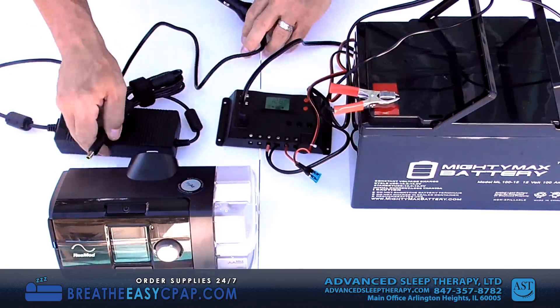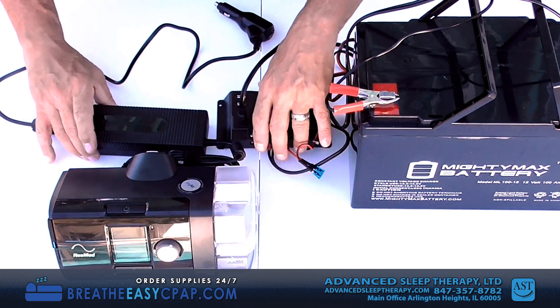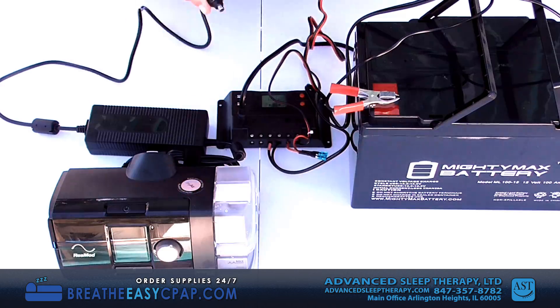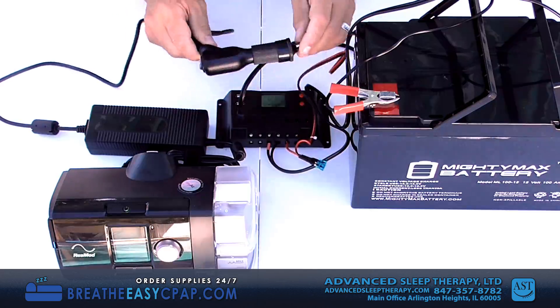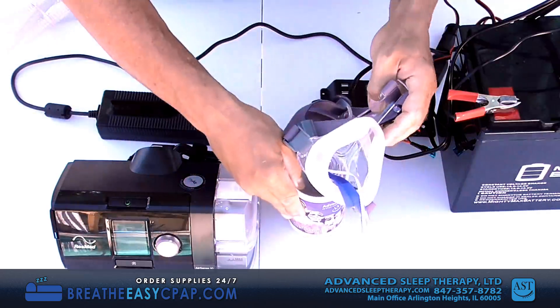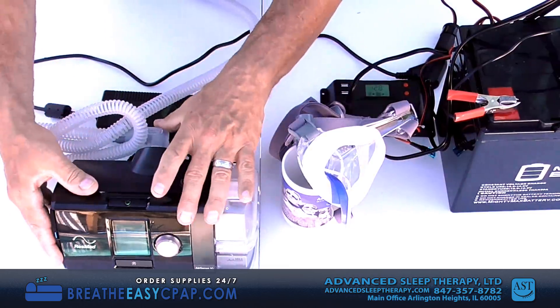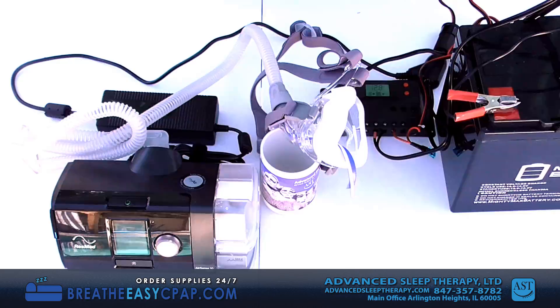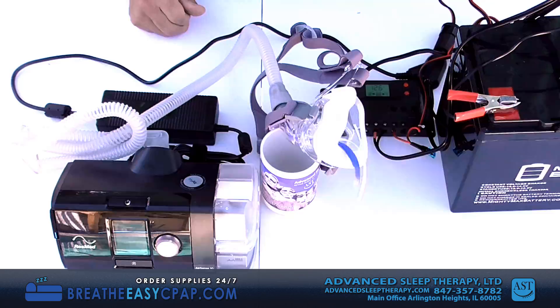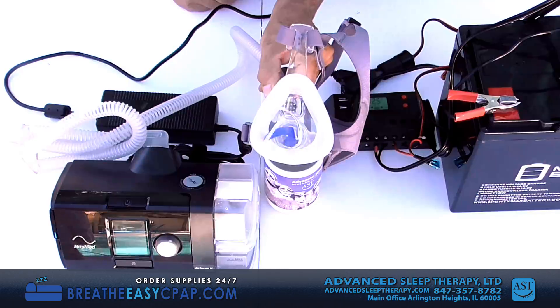Now you can set up your CPAP following the manufacturer's guidelines for 12-volt use. In this example, we are using a ResMed AirSense 10 with a humidifier and the ResMed 12-volt power converter. This setup should work with any piece of medical equipment that has a 12-volt plug — as you can see, it works perfectly.